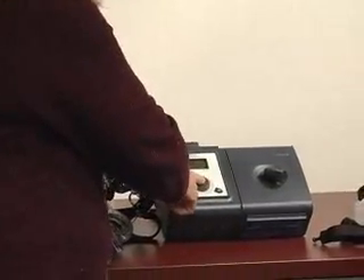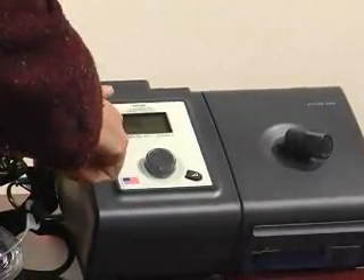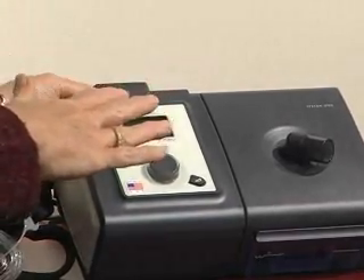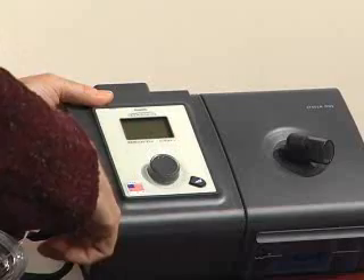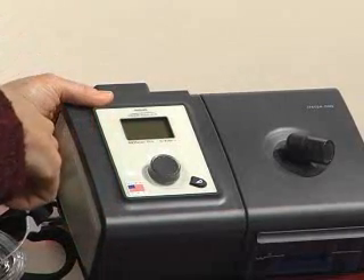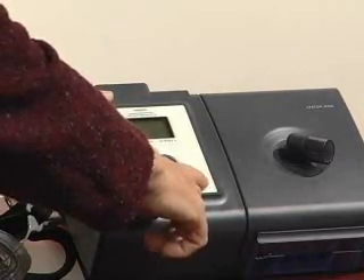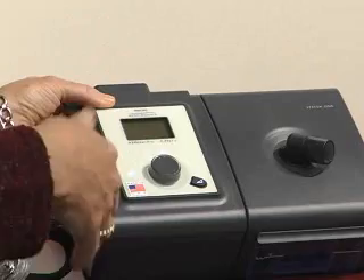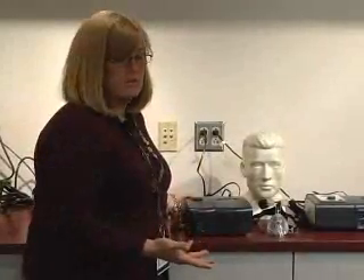To turn the M Series off, push and release the center round button. For the Sleep System 1, Philips Respironics unit, notice there are 4 squares in the window. The default square for every night use is the therapy square. The other squares are for informational purposes only, not anything anyone has to do on a daily basis. To turn this unit on, press and release the center round button. The unit will always go to its set pressure. If the patient is complaining that the pressure feels too much, use their ramp to lower pressure to the ramp setting and gradually work up over a 20-minute period. To turn the unit off, press and release.